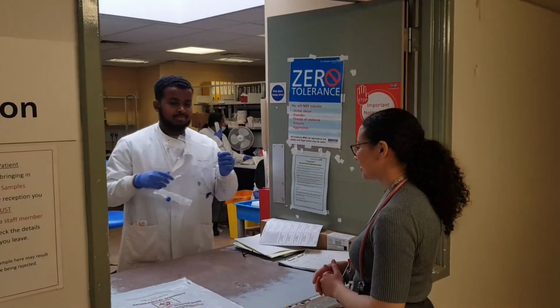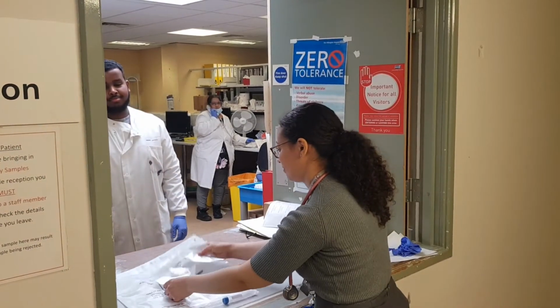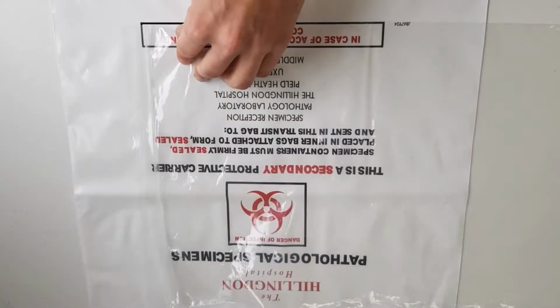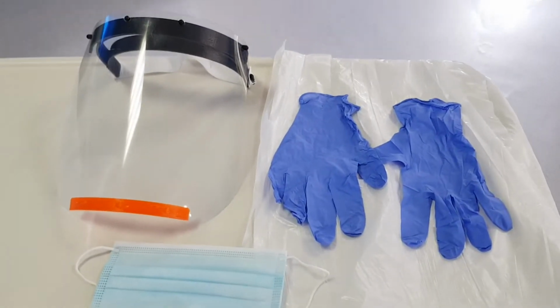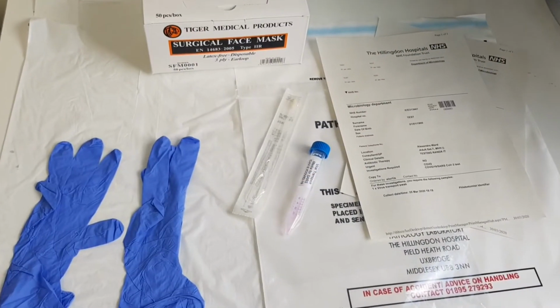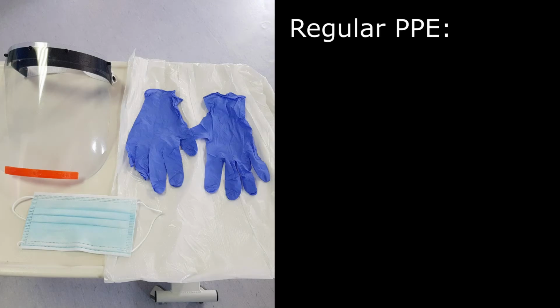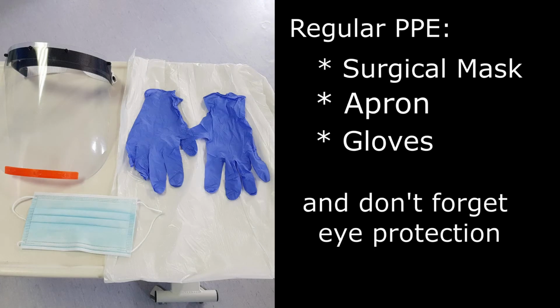To begin, collect the required kit from pathology specimen reception located on the first floor. This includes a white biohazard bag, a transparent resealable bag, a blue capped tube, and a swab. You will also need personal protective equipment or PPE, a regular pathology specimen bag, and 2 copies of the request form. In most cases, regular PPE, including a surgical mask, apron and gloves, is enough.